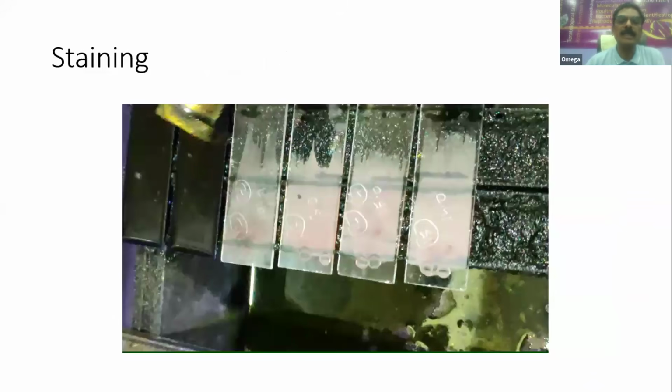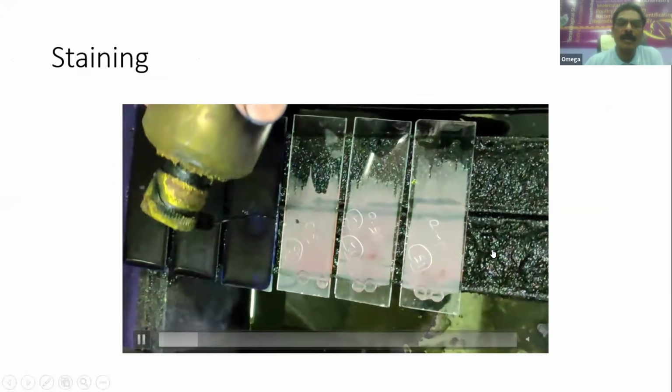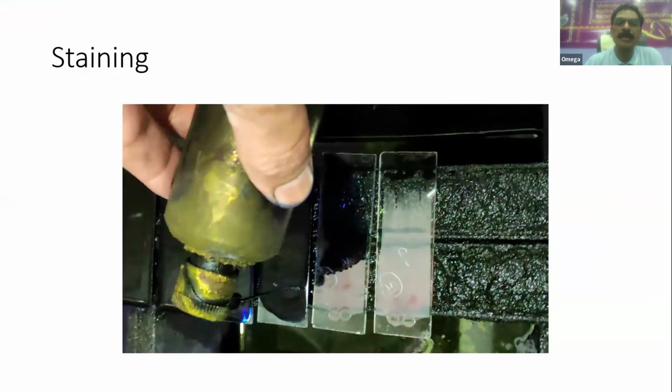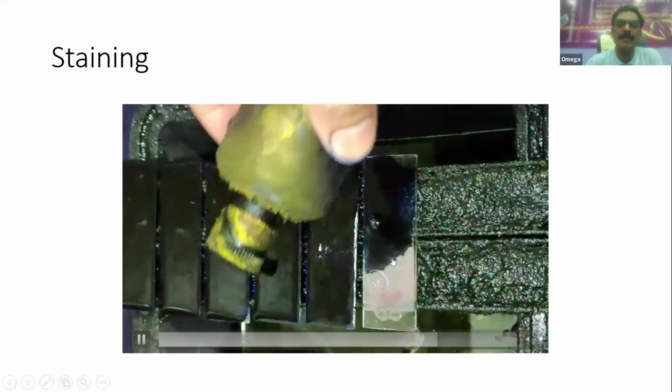Once the slides get dry, we should go for staining of the slides. Like this, put the stain and allow it for 1 to 2 minutes based on the concentration of our staining solution. This is a Leishman stain.